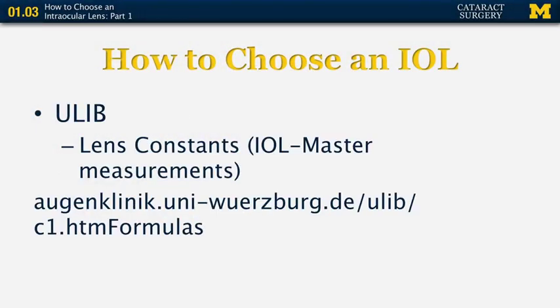So you could go on the web and you could look at the ULIB website. This is run by Dr. Haigis, and on it there are lens constants for all these formulas. They're designed for use with the IOLMaster, and they really are pretty good.